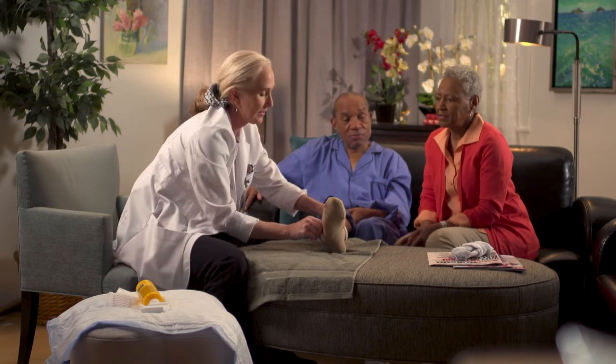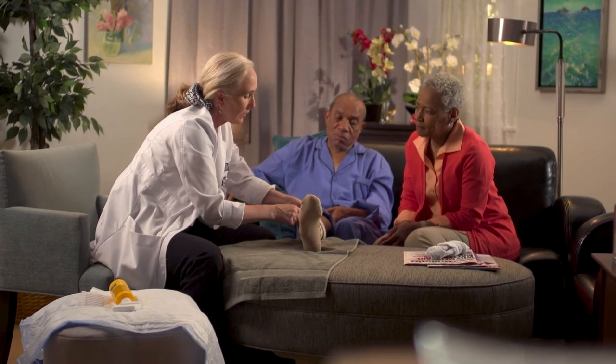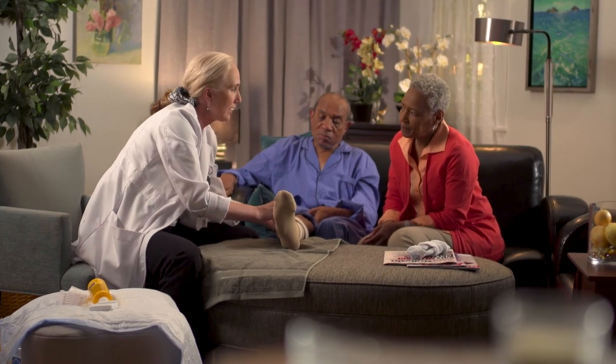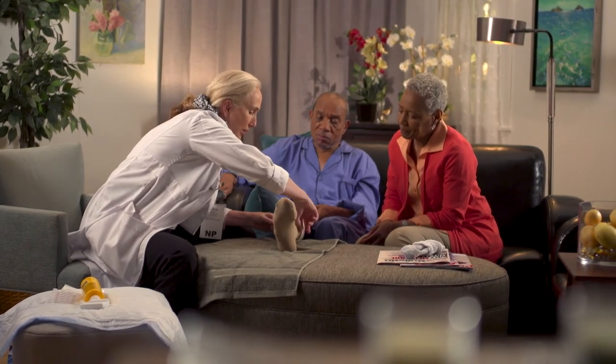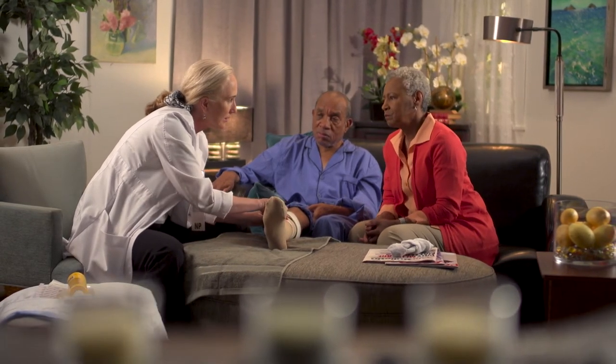What should I do if this gets dirty? It's nice to have a second one available, so you can wash one and have the other one ready for putting on. Usually it only needs to be changed about once every five days or so, unless it gets soiled.